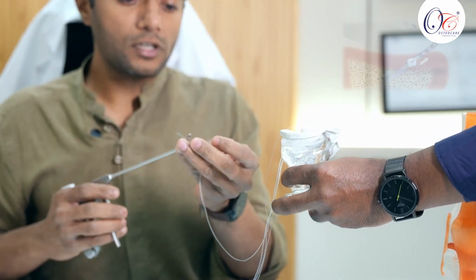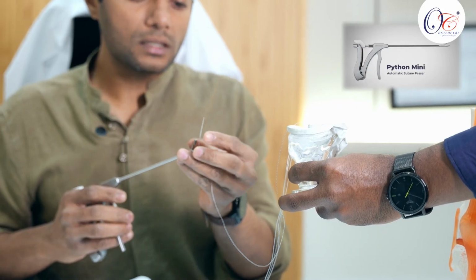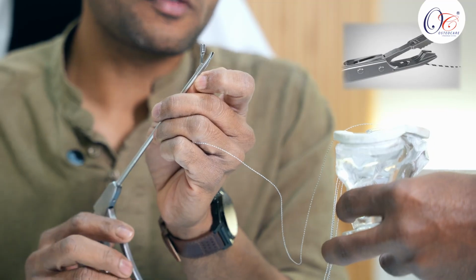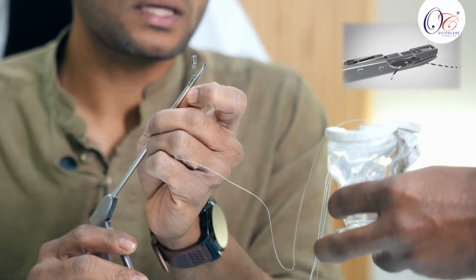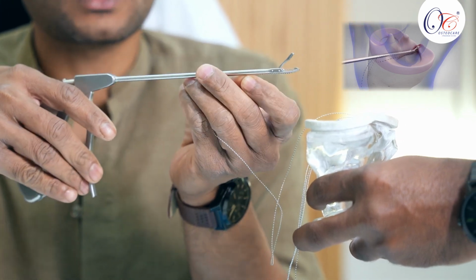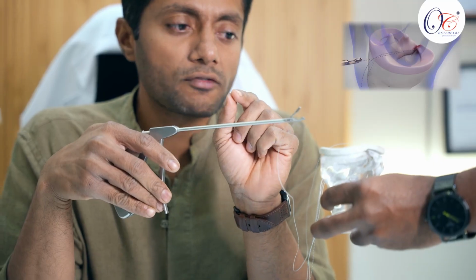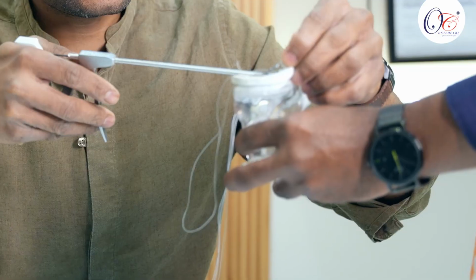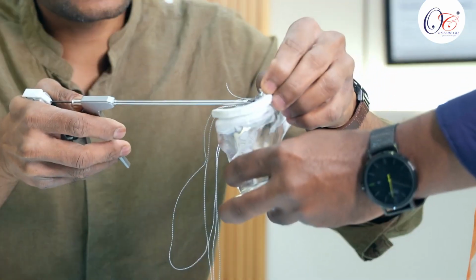So generally, the beautiful thing in this particular root anchor is that these are zero fiber wire. Zero fiber wire is very thin fiber wire which can be used to repair this meniscal root, and when we knot it, we get very low profile knots. Low profile knots are very important in order to avoid cartilage scuffing postoperatively. So we take bites through the root anchor in this manner.